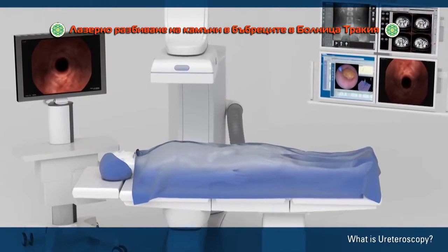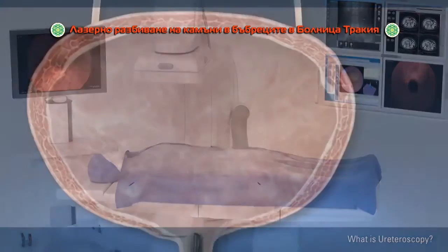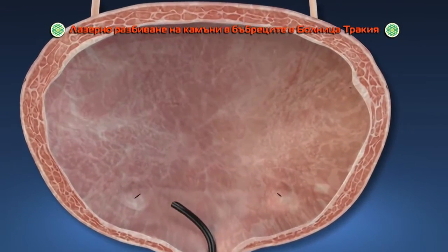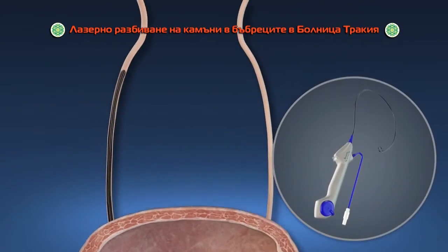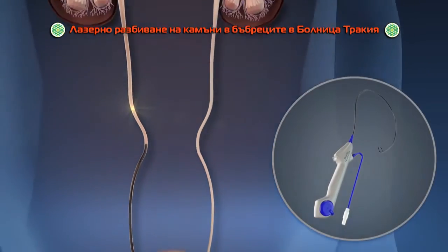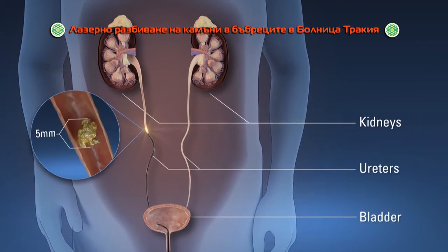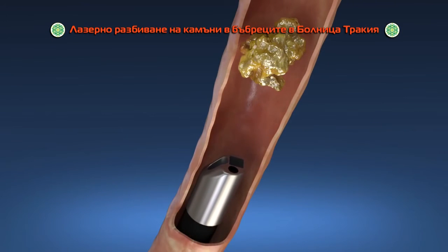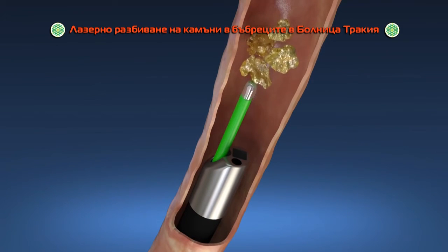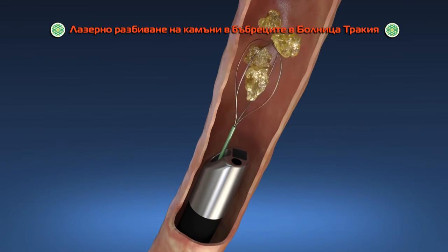However, the doctor does not make any surgical cuts or incisions on the outside of your body. Once you are under anesthesia, the doctor uses a videoscope called a ureteroscope to examine your urinary tract, including your kidneys, ureters, and bladder. The doctor locates the kidney stones and breaks them apart using laser energy, or removes the stones using a small basket.